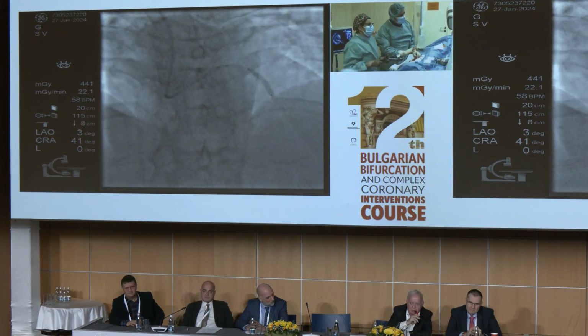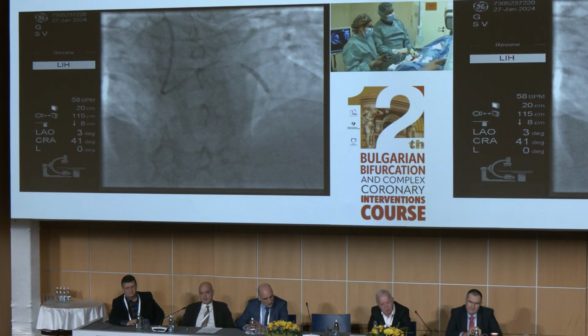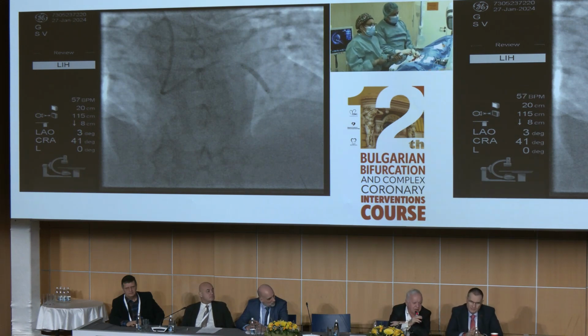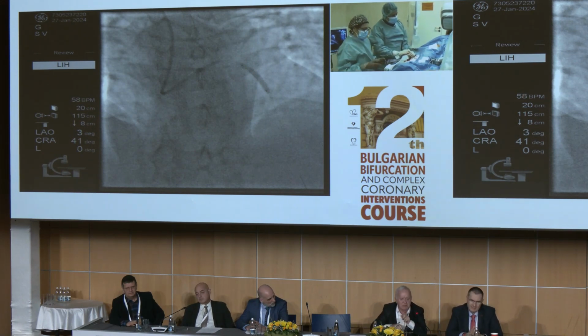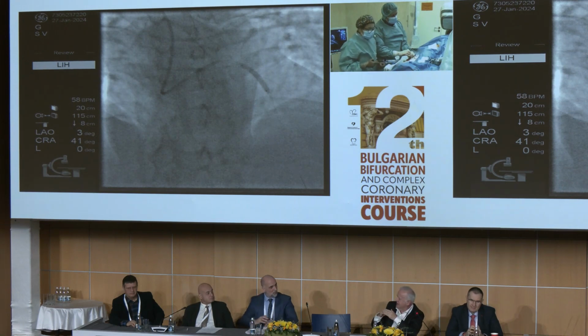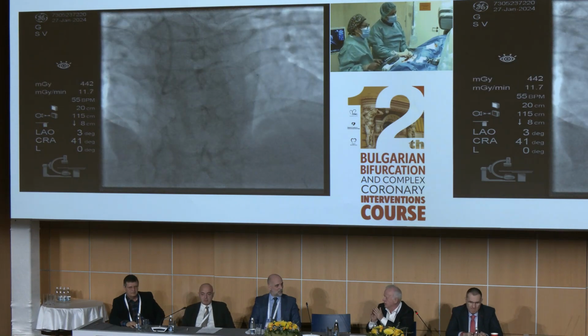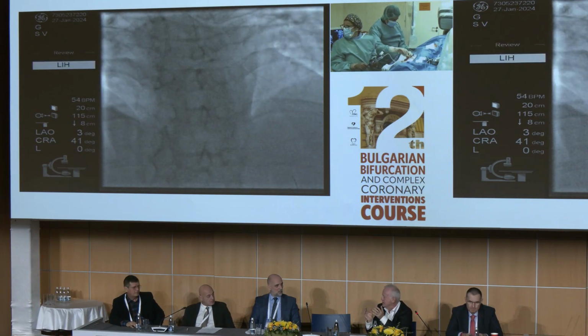Okay, this stent is well apposed. Still, we will do the pot. So you can deflate here. This is the third inflation. The third inflation does not have the same diameter as the second one. Of course, there is a limit to this. After three, they are reaching maximum plasticity.